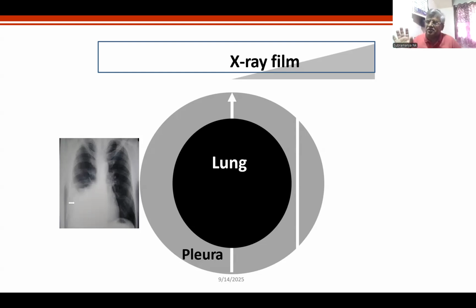All of you are now radiologists. I'm telling you, you are so good. Now we have understood the difference between a fluid and pneumonia. This is very, very important for you. I'll go further. I'm sorry, only workshops and long lectures can make you understand this. In short, sometimes in conference, I was asked to speak about chest X-ray for 20 minutes. I'll not be able to even explain you only on pleural effusion in 20 minutes. So let's understand today. And probably all of you are eating and you are comfortable.